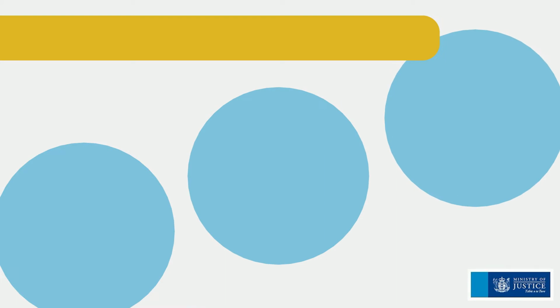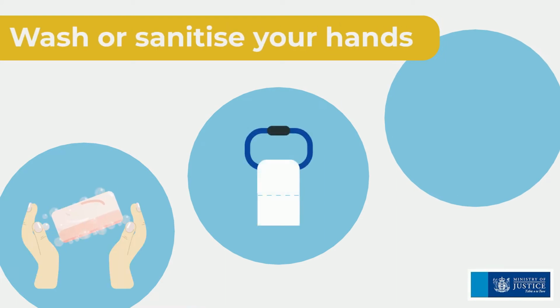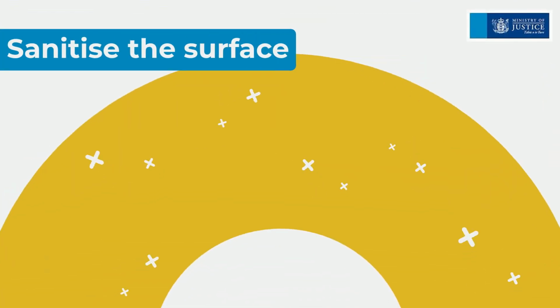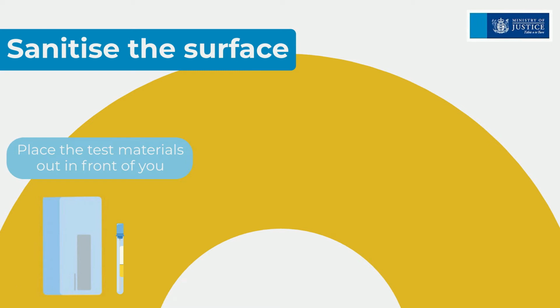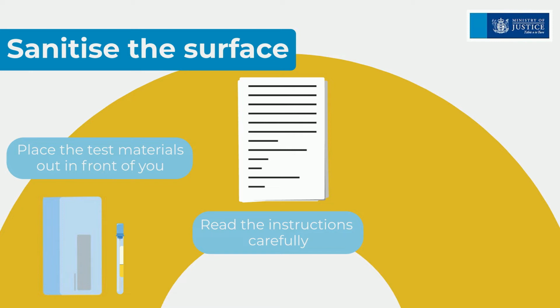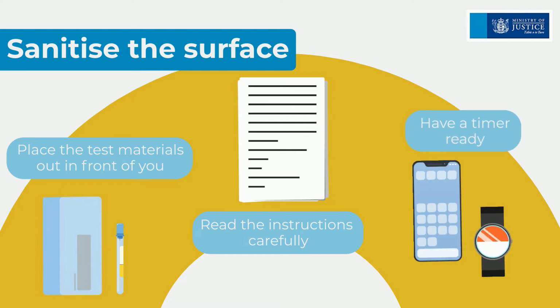We will now take you through how to take a test. Before taking the test, wash or sanitize your hands. Use a sanitized flat surface. Place the test materials out in front of you. Read through the instructions carefully, as some tests might have slightly different steps than demonstrated in this video, and have a timer ready.